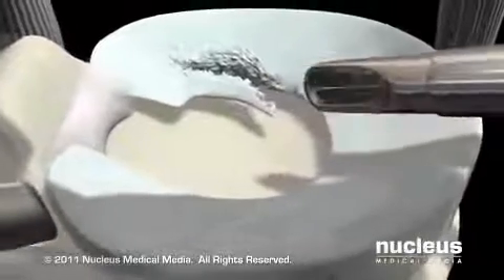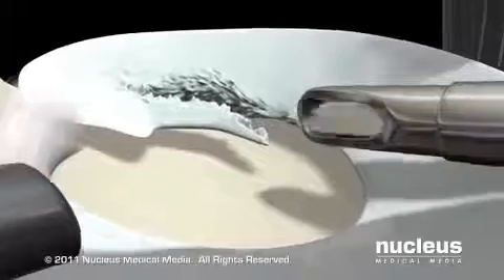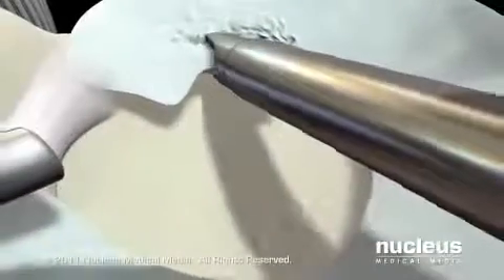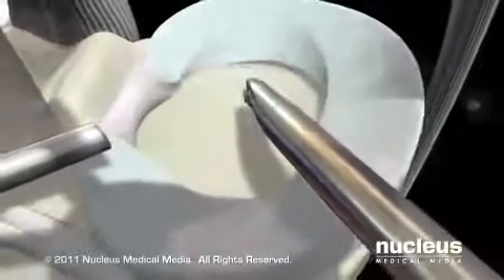Your surgeon will carefully examine the inside of your knee joint, locate the damage, remove any loose or severely injured parts, and use a shaving instrument to smooth any jagged edges. While it may be possible to repair the meniscus with small stitches, in most cases the damaged portion must be removed.